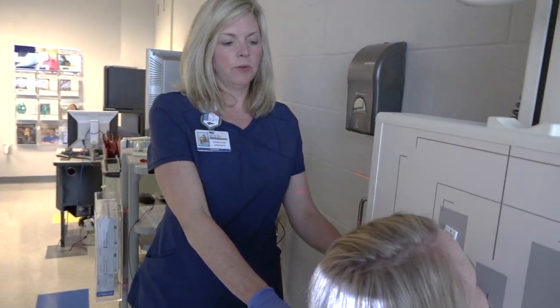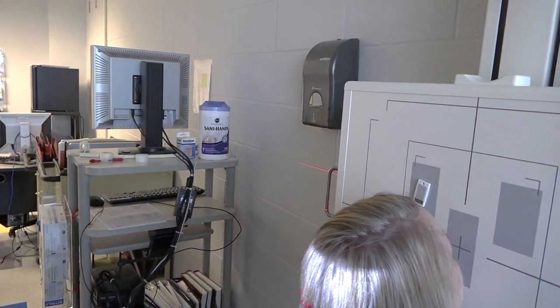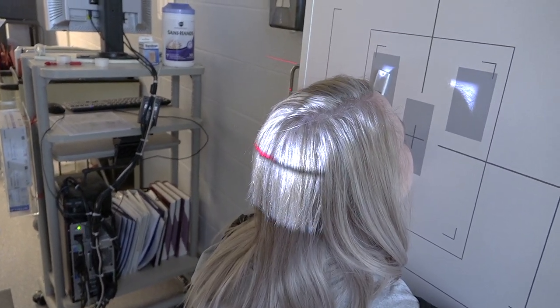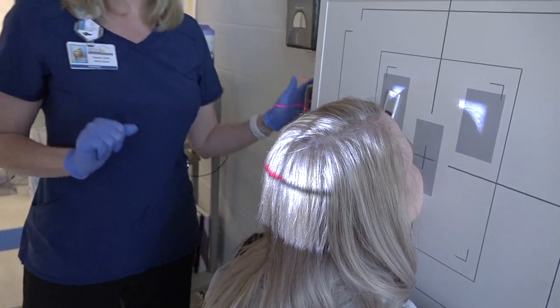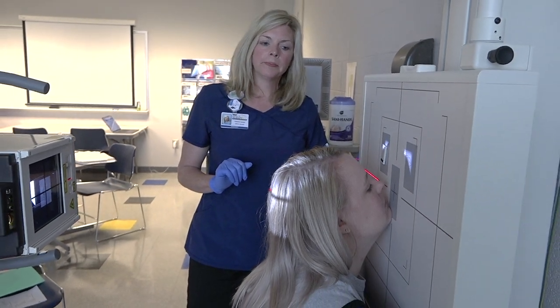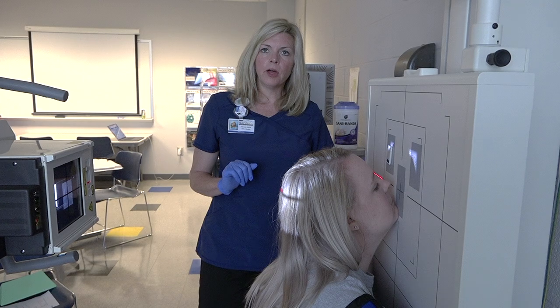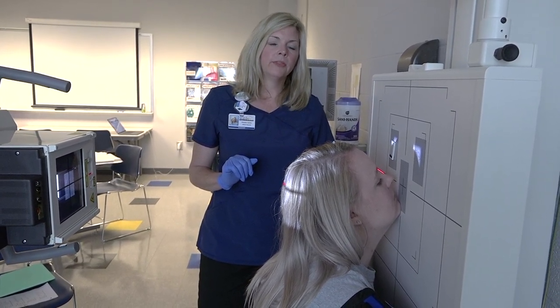So I'm going to move this board up. The easiest way is move the board up and then move your tube to match it. The anatomy demonstrated with the Waters is the frontal, the sphenoid, and the maxillary sinuses. There is an angle, the OML is at a 37-degree angle with the image receptor.